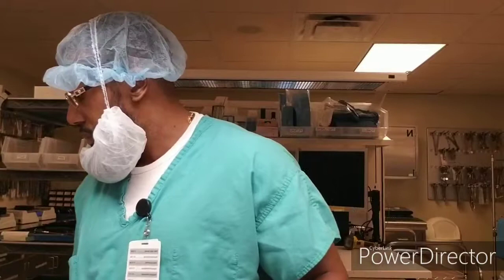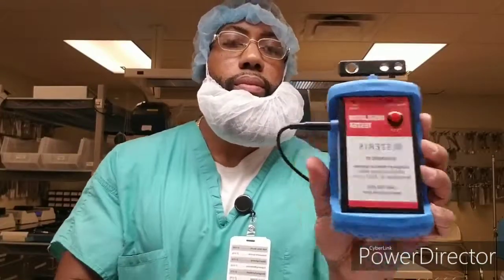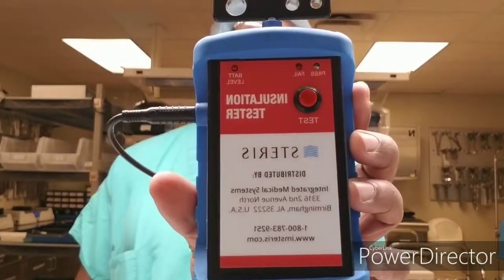Heads up — these instruments were blown out before they were assembled, and they were also checked in the serrations as well as the handles. Now as you see, this is a tester. There are different versions, but this is the basic generic version that most hospitals do have.